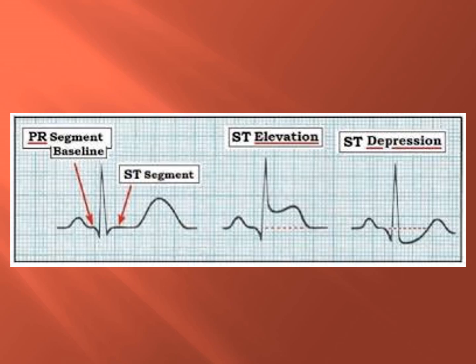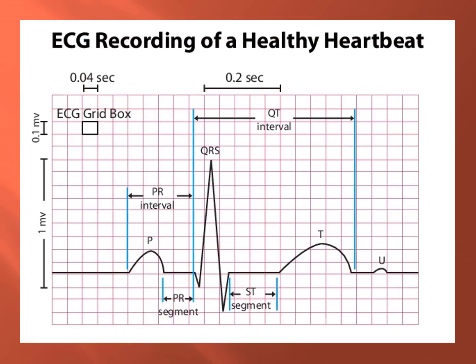The next one that you see here in the middle, the ST segment is elevated, so that would be a STEMI, right? It's ST elevated myocardial infarction. Elevation is myocardial injury or ischemia. Depression usually means ischemia. It's been going on for a long time. Some people might have just a normal baseline where it goes below because they have a history of an MI, so things that you need to be aware of if that's their normal. Obviously, we're going to get their troponin values as well. So it's pretty important to look at the ST segments.